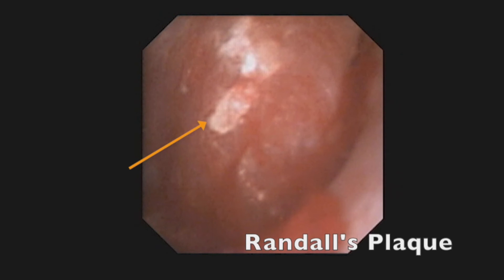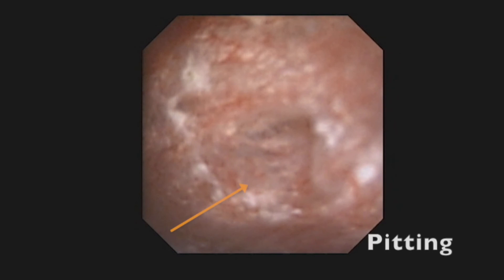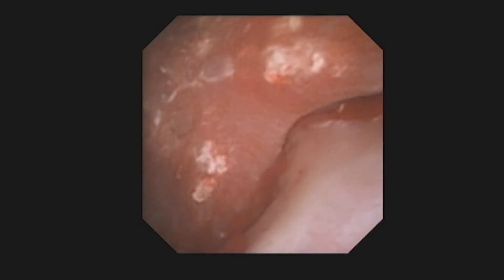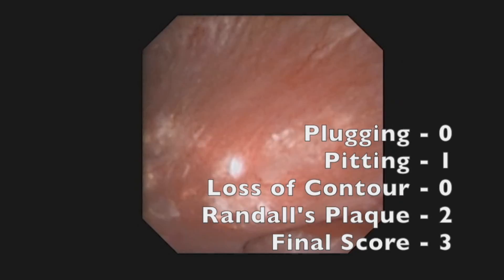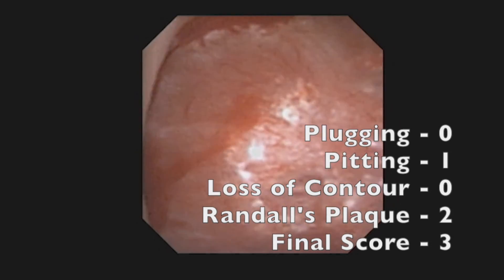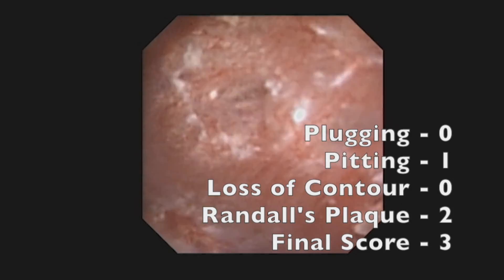In this final example, abundant Randall's plaque can be seen. There is a large superficial pit in the papilla, but less than 25% of the entire papillary surface is involved. Final score is 3: 0 for plugging, 1 for pitting, 0 for loss of contour, and 2 for Randall's plaque.